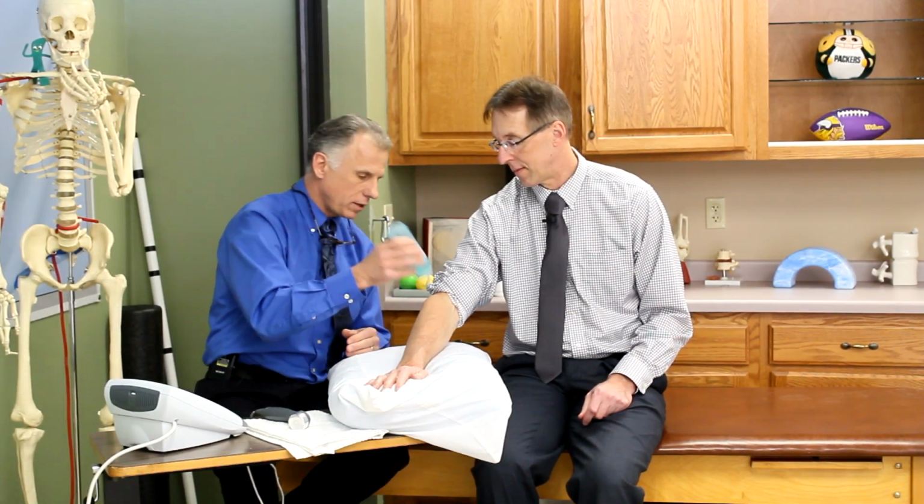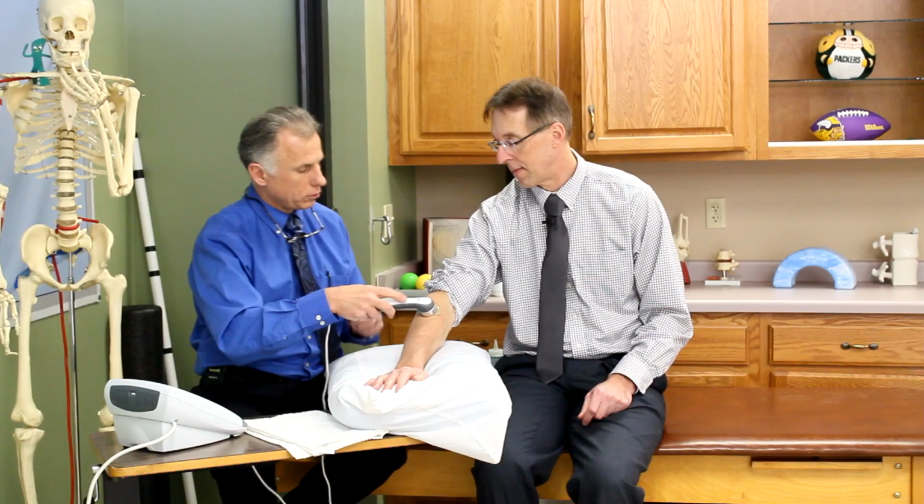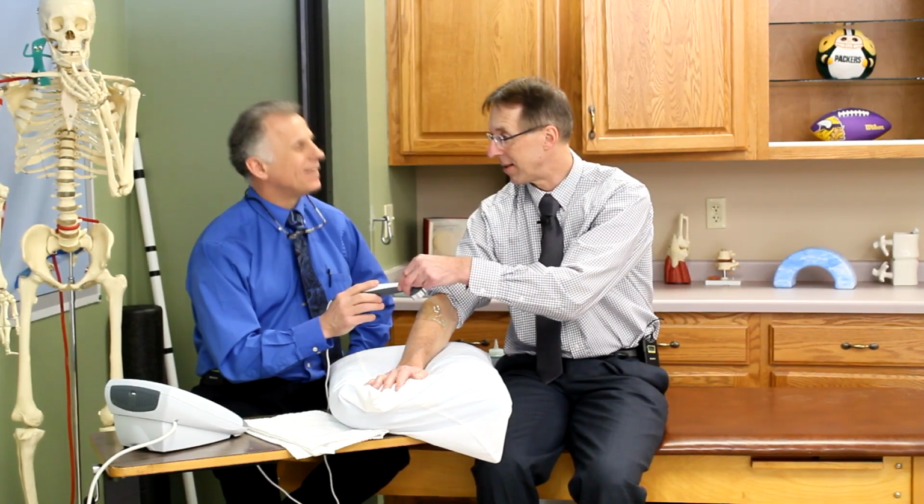So you're going to use gel, and this is just inert gel, some basic gel. There's nothing in this gel as far as medication. It's simply to help conduct the ultrasound vibrations through the skin, plus it's a lubricant so that you can easily work that. You're going to turn the unit on. One of the precautions is that you're supposed to maintain contact the entire time you're doing the ultrasound. It's not a precaution for the patient. It's a precaution for the device, because you can ruin the head if you keep it away from the surface.